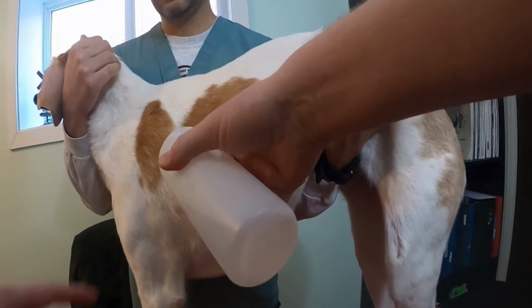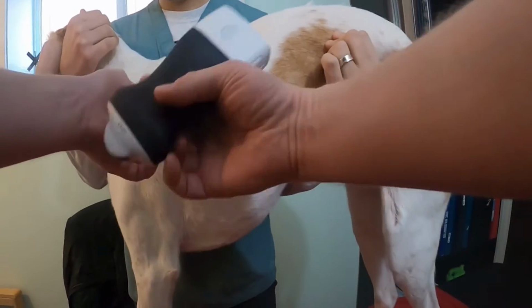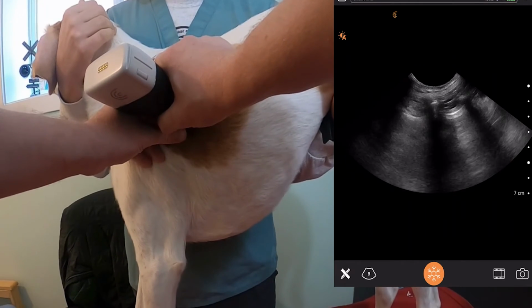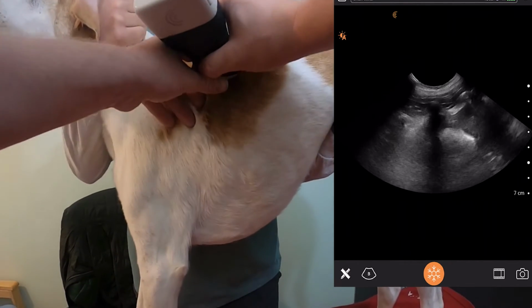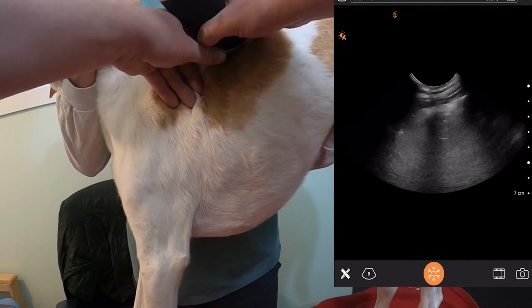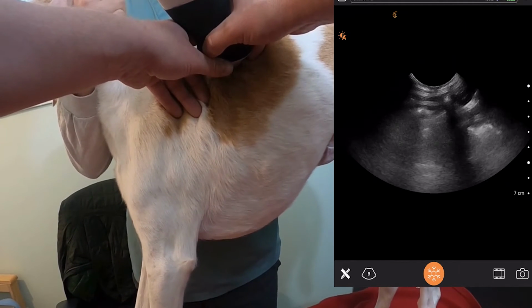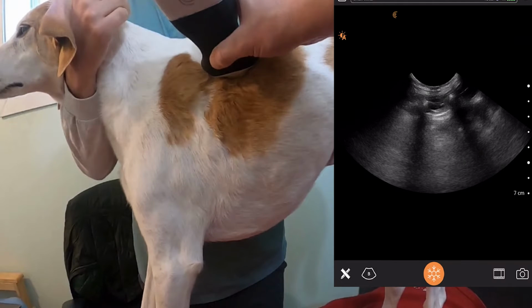I need to get up here. So how am I going to do that? Pull the skin down, a little alcohol here, pop the probe on with a marker towards the head, separate the fur, and we're just basically going to go straight back until we find that curtain sign. Then we're going to go straight up until we lose the pleural line and the hypaxial muscles come back down until we just see that curtain sign again and that pleural line, and we assess that region there for the glide sign. That is how we rapidly rule out pneumothorax.